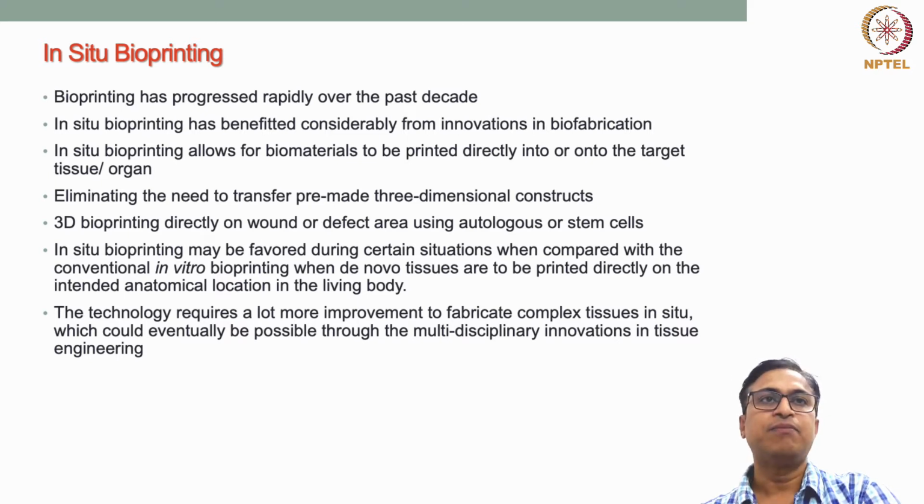The other thing is that the bioprinting technology has to be such that it should not induce any type of toxicity or any hazardous condition to the patient's body, because here we are directly printing on the patient, and the patient's wound is highly delicate.